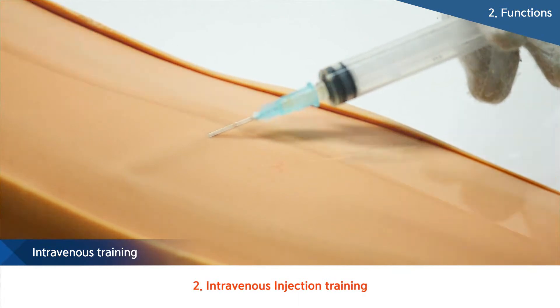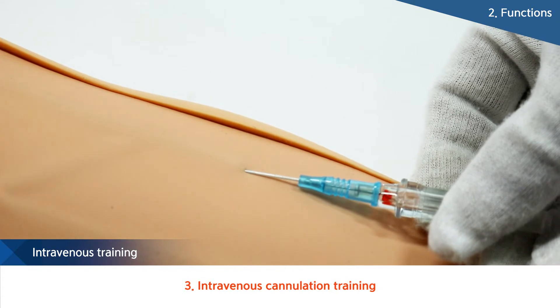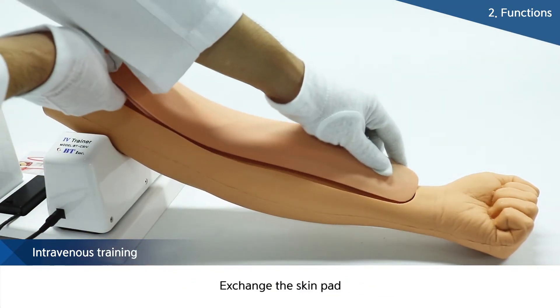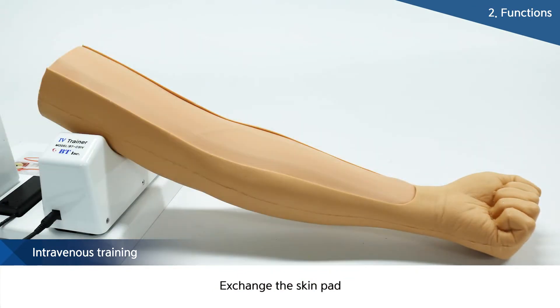As the skin pad is consumable, a pad with all such features can't be used forever and needs to be replaced. BT products with integrated skin and veins were designed in a way that the skin can be more easily replaced than other products, thus enhancing the convenience of users.